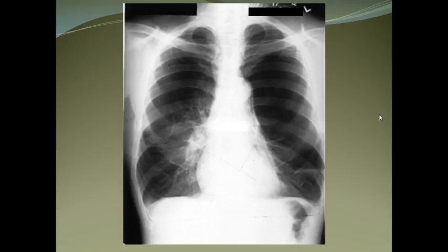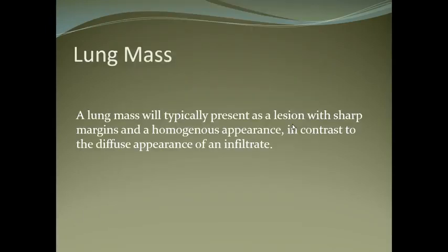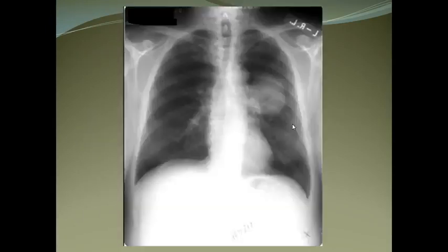Emphysema appears as over-inflated lungs with more air than normal in the alveoli. The diaphragms are usually flat and the lungs are over-inflated.